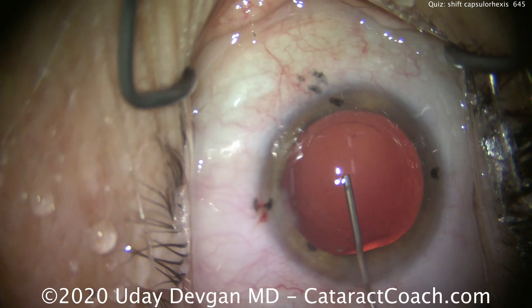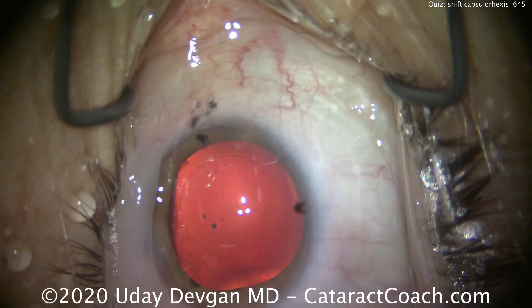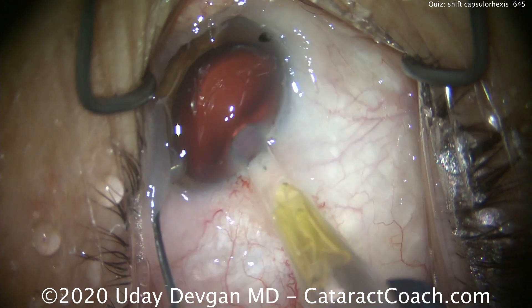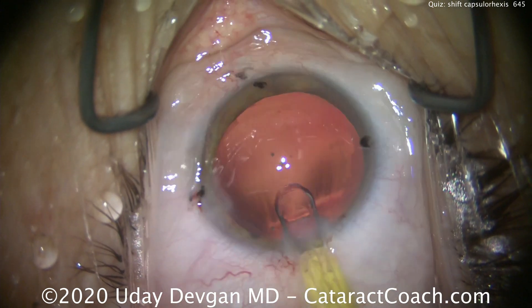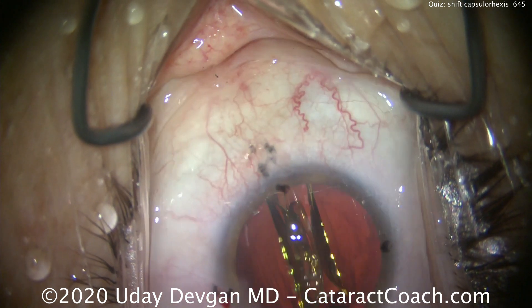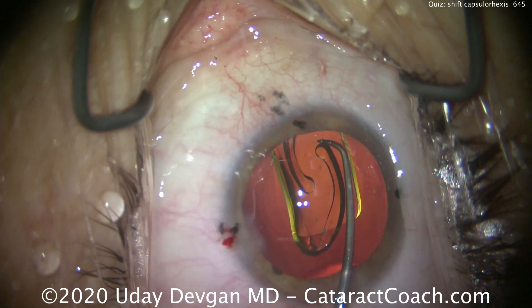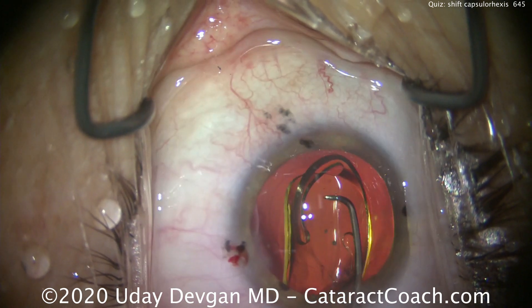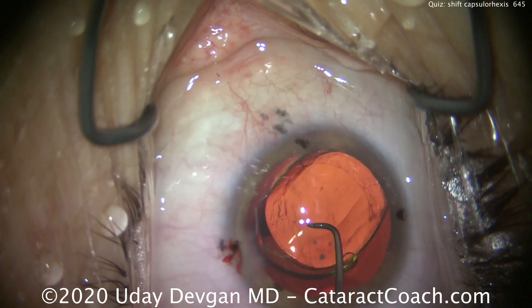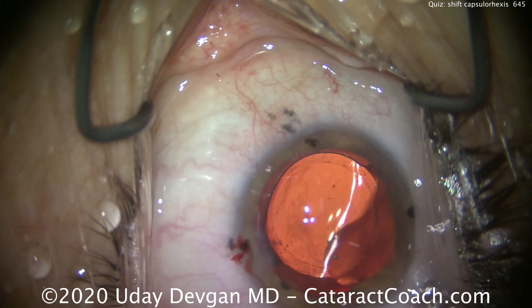Here's filling the capsular bag with our viscoelastic — there's that capsular axis. It may appear a little bit decentered, but look what happens as I get the lens in the eye: now we'll have two different Purkinje images. The first Purkinje image is the reflection off of the anterior surface of the cornea. We'll also get an inverted fourth Purkinje image from the back surface of the IOL. Once the IOL unfolds and takes its planar or flat configuration, there we can now see the other Purkinje image.